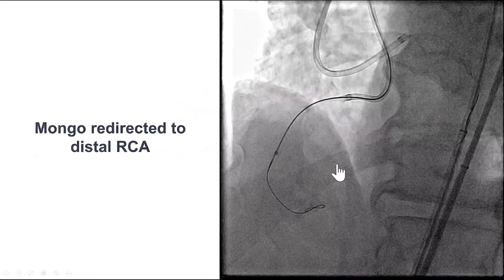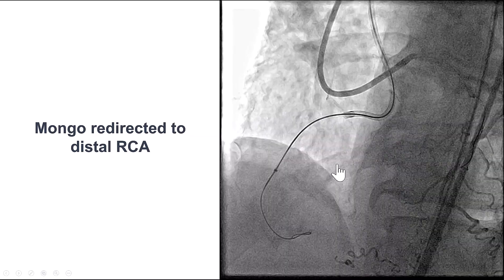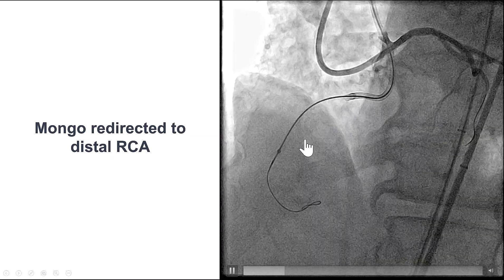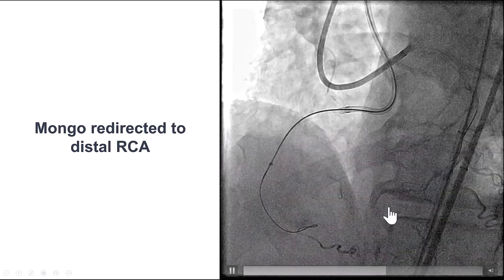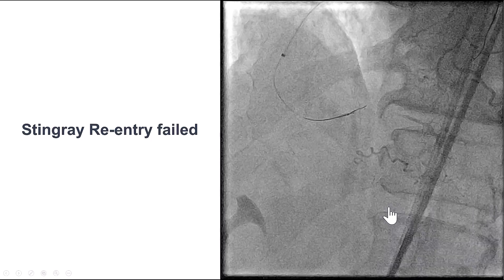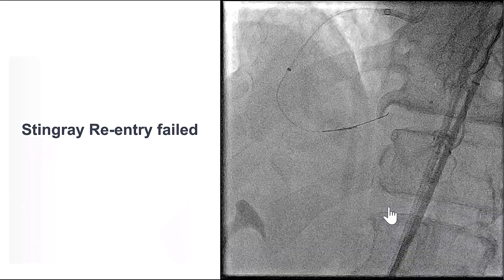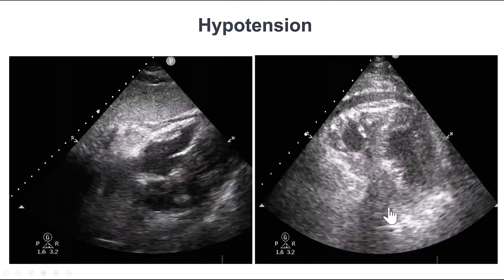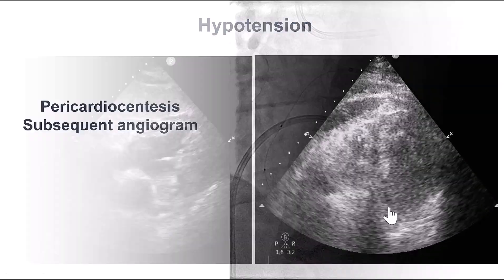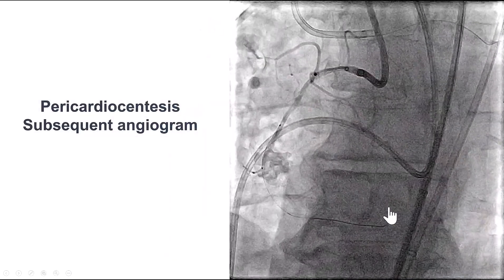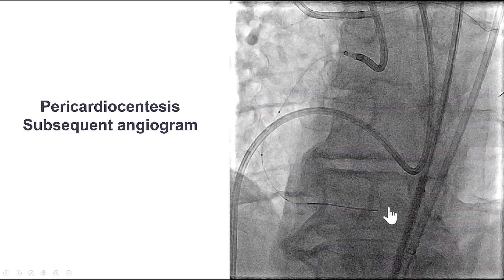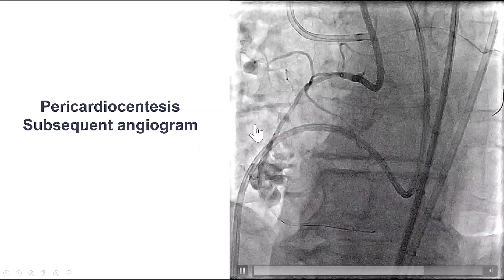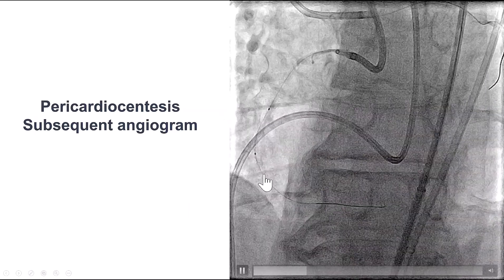As expected, there was no effusion on the echocardiogram initially. We advanced the guide extension further down with the idea of using it to tamponade the site of perforation, and then advanced the knuckle wire. We performed a re-entry attempt using the Stingray balloon, but we were unable to get into the true lumen. A few minutes later the patient developed hypotension and now had a pericardial effusion. We performed pericardiocentesis, and when we moved the guide extension back, we saw there was still a perforation — likely an intramural hematoma in the mid-right coronary artery.